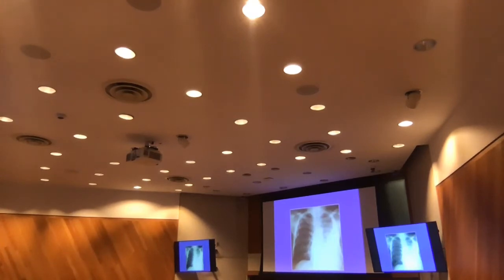This is the posterior. First, second, third, fourth, fifth, sixth, seventh, eighth, ninth. This is the ninth rib, right? If I don't want to go too low, I may puncture the spleen. If I want to avoid the spleen, because my fluid allows me to go one space higher, you could do eight. But the ninth is the most common. I can go one up or down. All right.